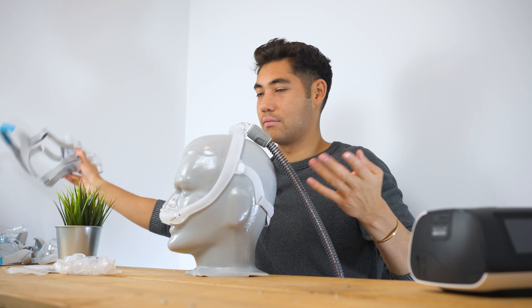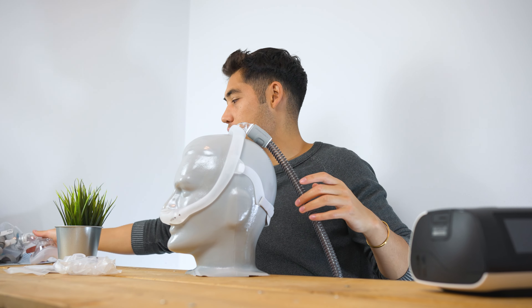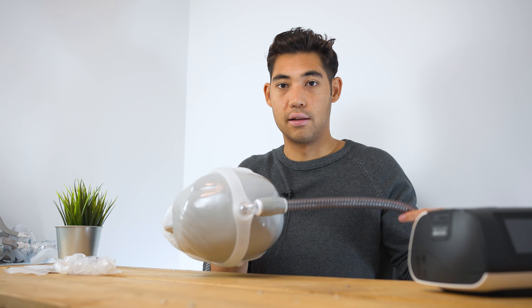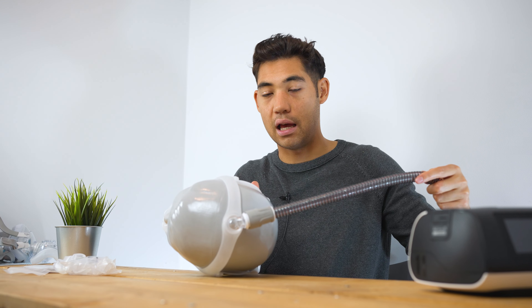It's a very interesting mask. I have some mixed feelings about it, but we're just going to walk through the mask and see if it's something that you might want to consider getting. It does have its pros, it does have its cons, and overall it's a great lightweight mask. It just doesn't work for me personally.